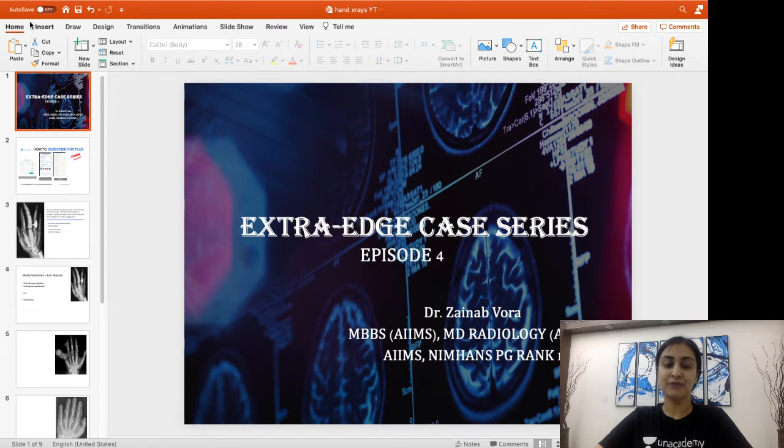I'm bringing to you our fourth episode in our series which is focusing on extra edge case scenarios where we look at multiple important image-based questions from radiology. So if you've missed out on the first three episodes, where we've covered mesial temporal sclerosis, temporal bone fractures and its types, and pancreatitis, basically the spectrum of pancreatitis, and integrated that important topic of IgG4 related disease, which is very important, a potential question for your upcoming exams.